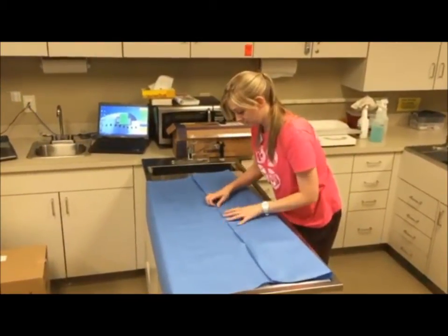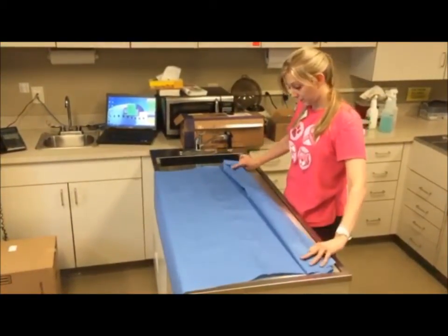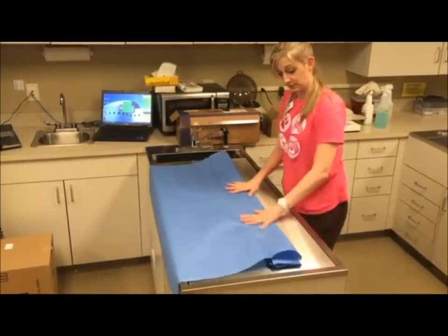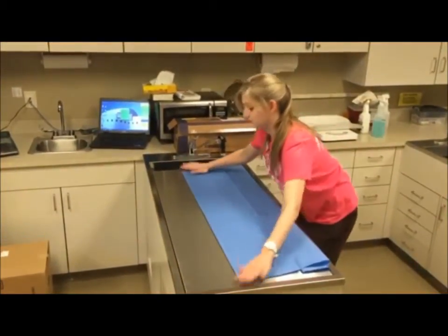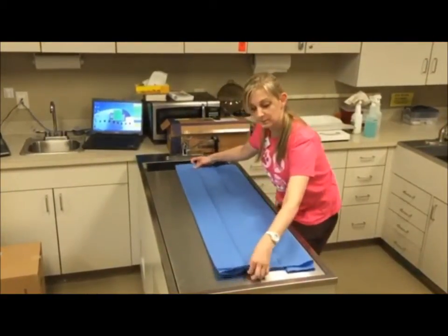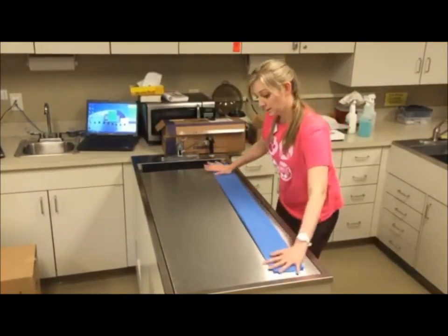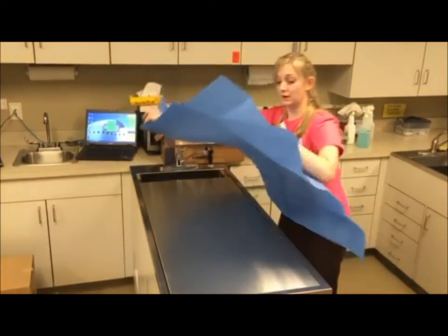Fold into the middle to use that nice crisp line that it already gives you. Fold backwards and then fold under — we're going for an accordion. Once this is all folded I'll show you the purpose of that. Fold back to the middle, back to the seam, under, and then over. You want the doctor to be able to grab a corner, pull up and then unfold. That's all there is to it.